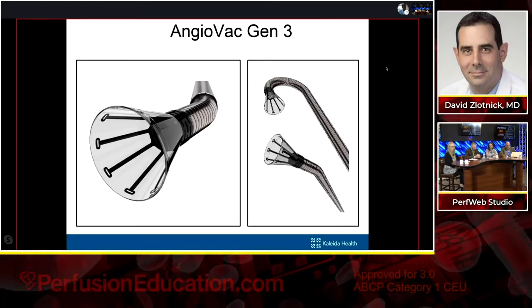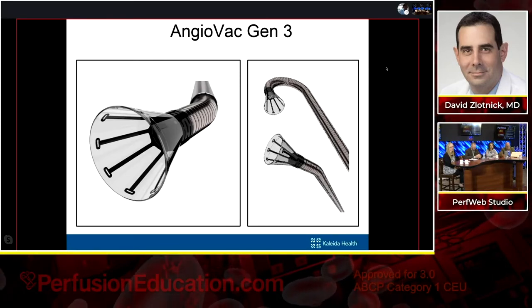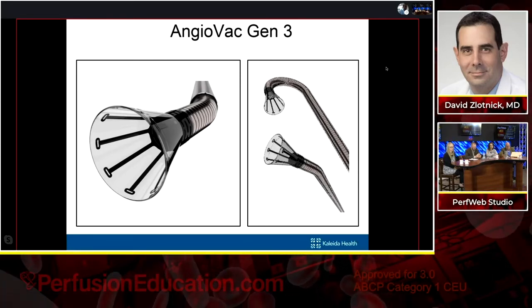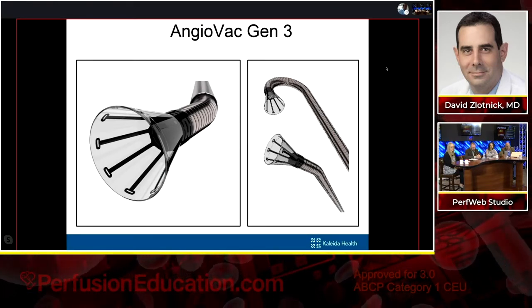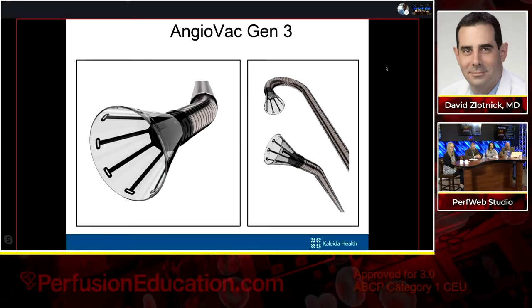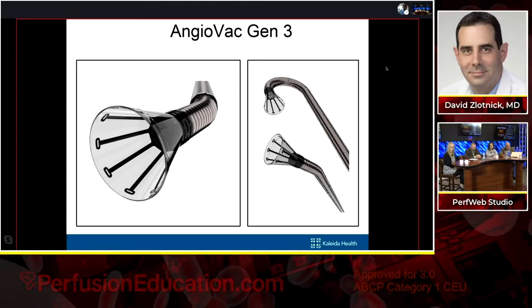So the snare allowed us to maneuver the device, but thankfully AngioDynamics came out with Gen 3 after seeing what we struggled with. And I think Mark went over this, but basically there's the oversheath and there are two different cannulas. There's the C180 and the C20.